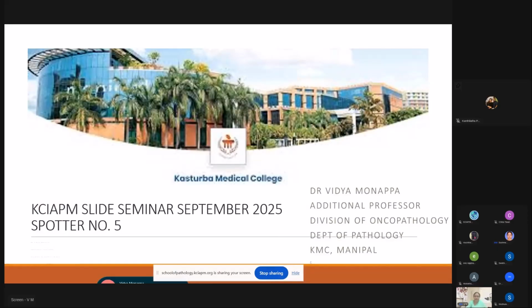Okay. Excellent job, Dr. Chitra. I think you have made my job very easy here. You have covered whatever differentials and given the IHC. That's a very good job done.